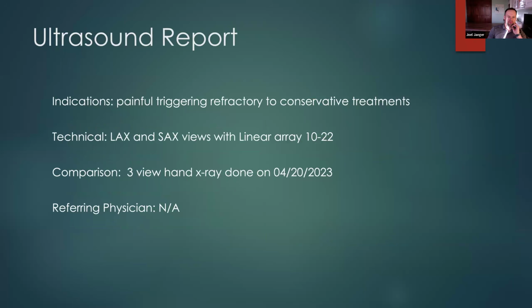Now that we've gone through this case and looked at our ultrasound images, we need to do a little editorial on what we saw. When you're writing an ultrasound report, we need to start with the basic things that we need to include in every ultrasound report. First of all, why did we do it? What were our indications for going in to look at this? How did we do it? What did we use to take a look at these areas?